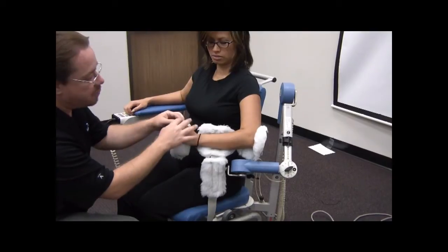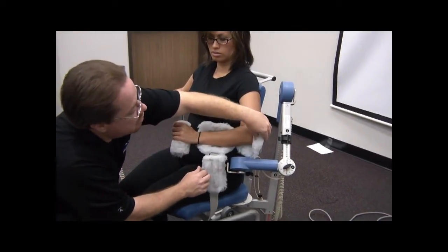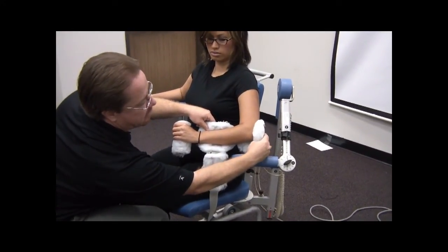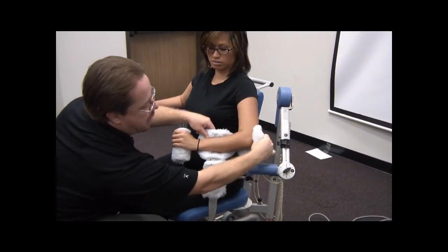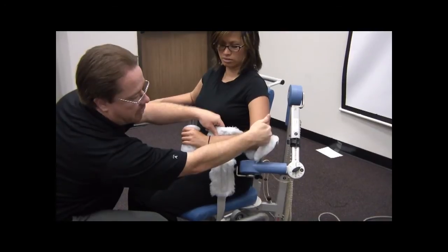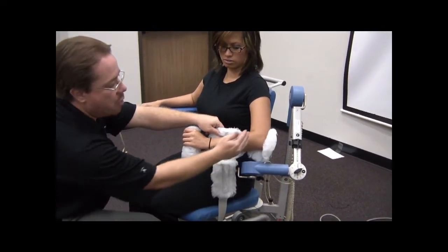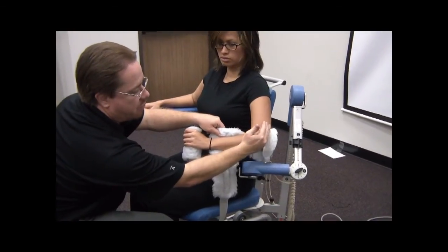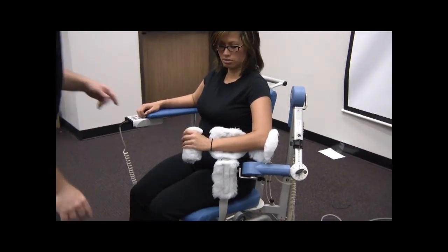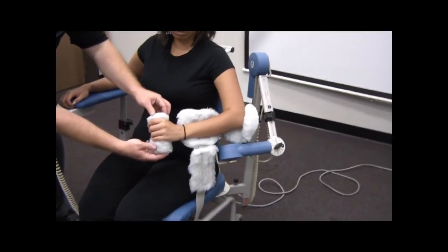And to do that, sometimes patients have to grip near the top of the handle, okay? This will move so that we can angle it for her arm. So we don't want it like that, digging into her arm there. We don't want it down there because it's not supporting the back of the arm. We want it angled with her arm, okay? Now we want the elbow, the back of the arm to rest against the pad, and we can unloosen number 5 over here, right next to her, and now we can adjust this.